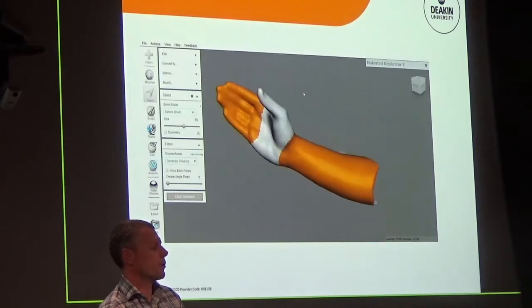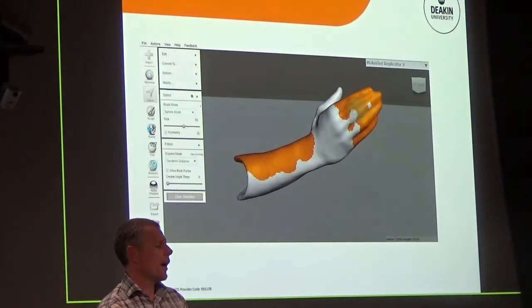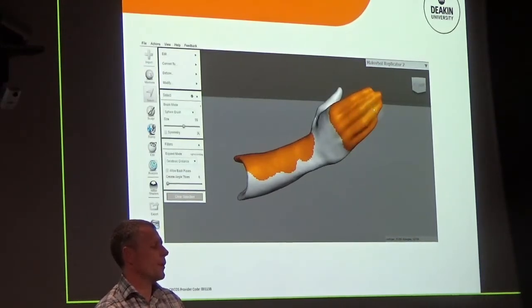Actually go through all that. I'll just roll it through to the bit where it removes a bit of the arm. It's exciting. So through this, I'm just highlighting the parts that I think might be useful for maybe a thumb spica splint, and going, okay, that's roughly about the creases that I want. Don't want to go beyond the wrist.